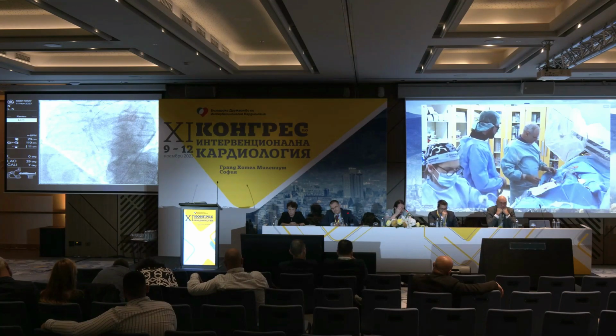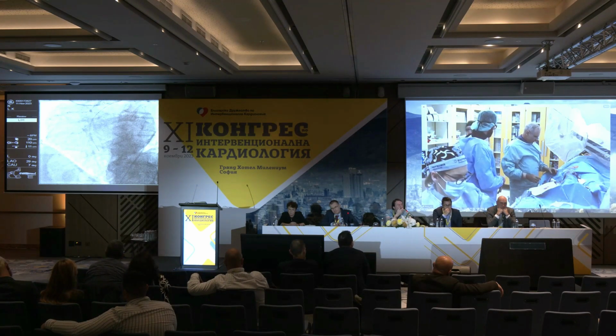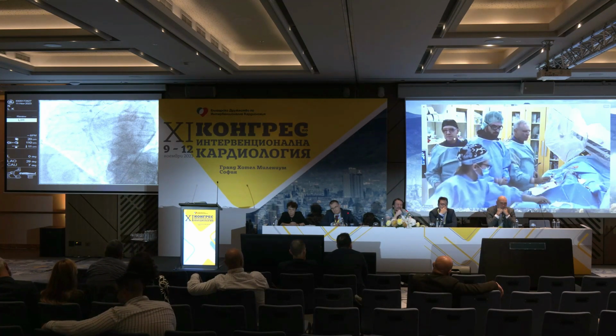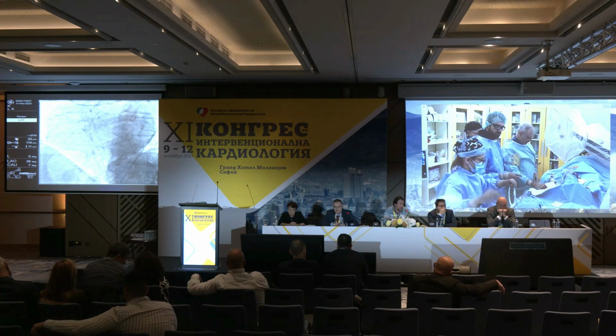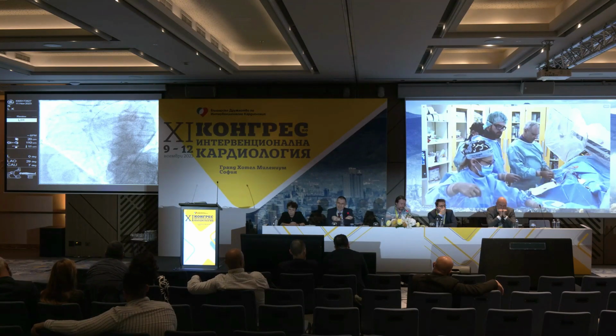So the answer is never. To give antegrade contrast, as I did now, it's a compromise. So you did something wrong? Yes. Okay.